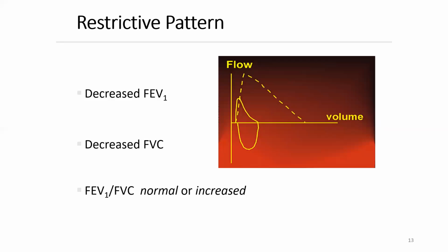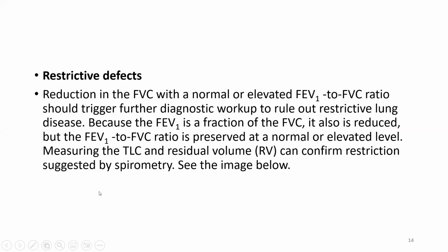This is the restrictive pattern of the spirometry. It is smaller in volume. Decreased FEV1, decreased FVC, but the ratio is normal or maybe increased. We mean that in restrictive pattern, both are decreased, but the ratio between them is preserved or may be increased in restrictive pattern.